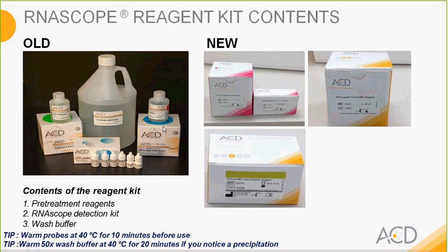The next is the reagent kit. Some of you are familiar with the reagent kit on the left. To the right, we have performed some improvement in the reagent packaging outlook and information on the packaging, which includes storage conditions and expiration dates, as well as lot numbers. In the reagent kit, just remember to warm probes at 40 degrees before you begin in case there's precipitation, and this also applies to the 50x wash buffer. It's important to notice that nothing has changed in these reagents, only the packaging has changed.